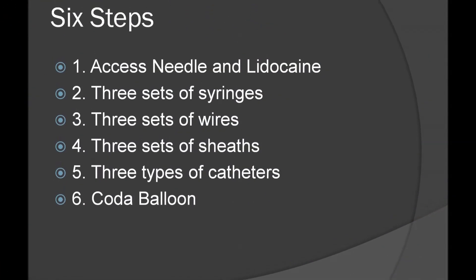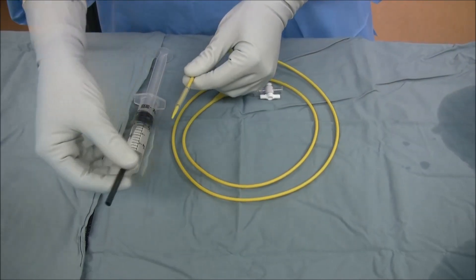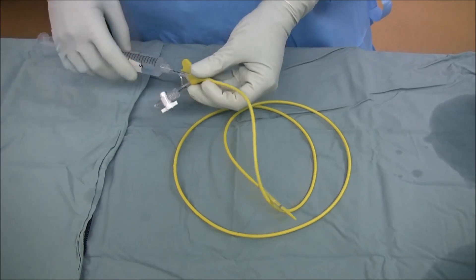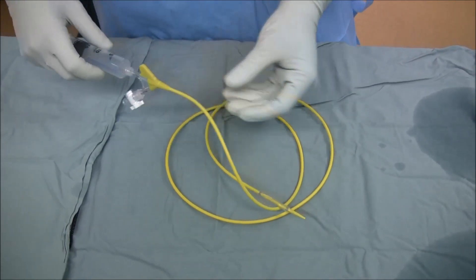The final step is the preparation of the Coda balloon. The protective black sleeve is removed and discarded, and the inline port — not the balloon port with the white stopcock — is flushed.